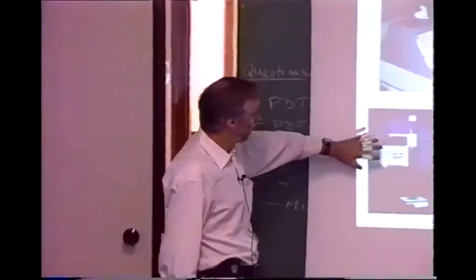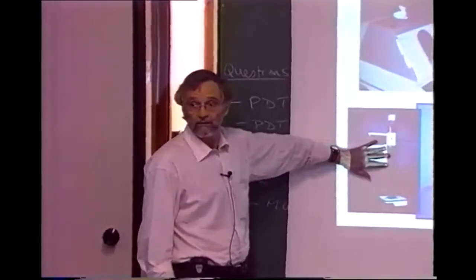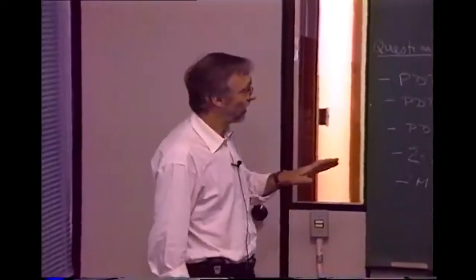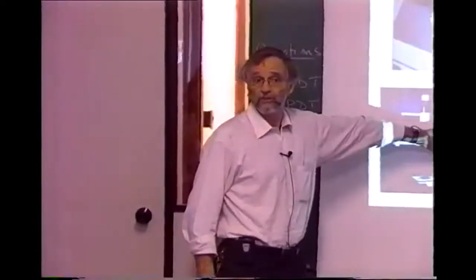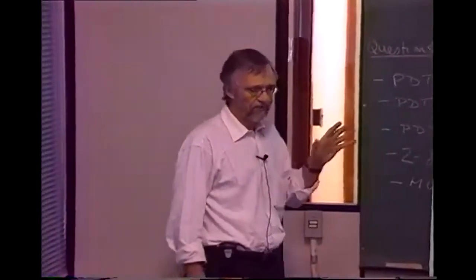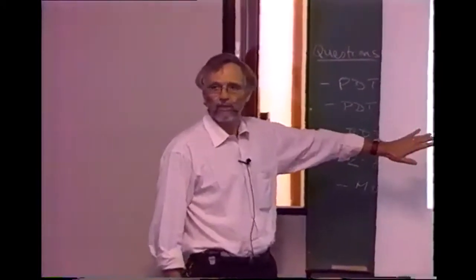This is very clinical. It costs about $2,000. Not too bad. It just switches on and off. Very reliable. If you want to treat a large area, this is a pretty nice technological solution. So, although generally lamps are dying out and being replaced by LEDs, there are some circumstances where it's still probably competitive.